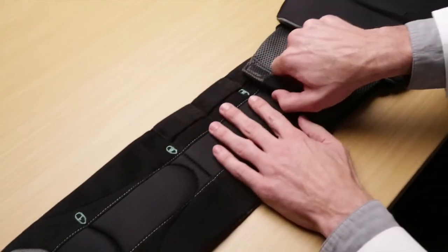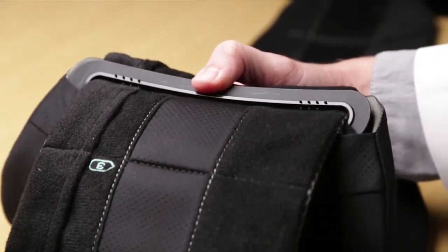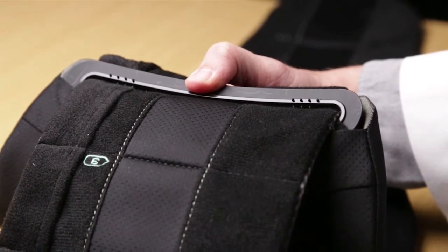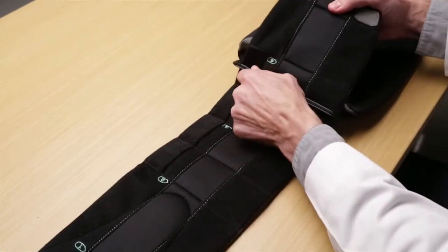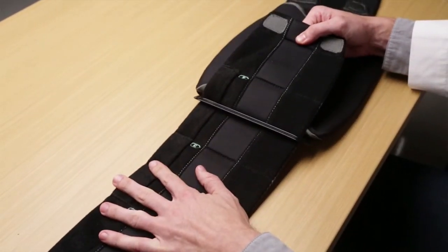Peel back the hook material from the folded over end of the belt and free the fabric from the small molded hooks inside the plastic slot. Now slide the belt end toward the appropriate reference number, leaving a little extra room for the universal strut.